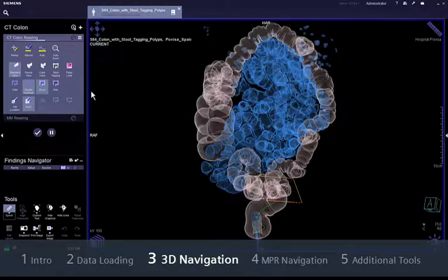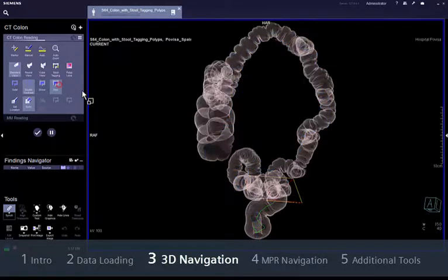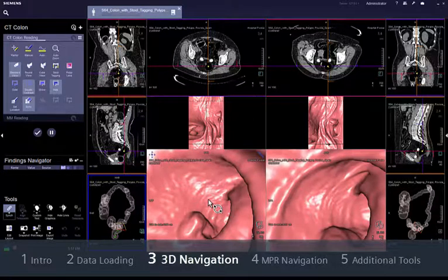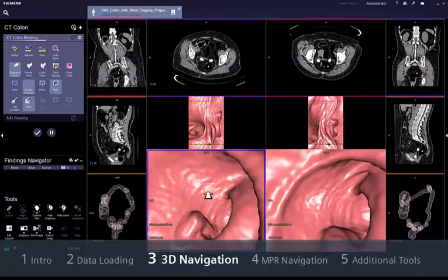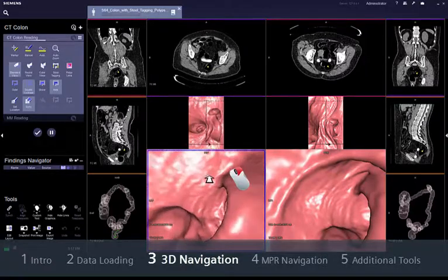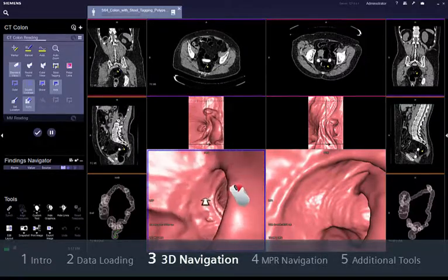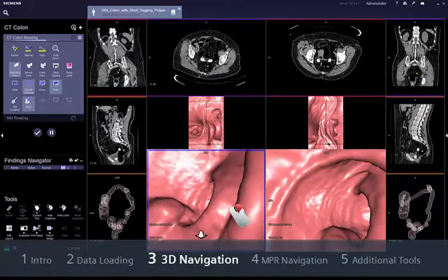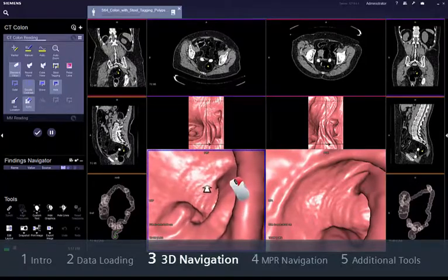Let's start the fly-through in the endoluminal segment of the supine data set. The virtual endoscope is automatically positioned in the rectum and ready to start navigation. Just hold the right mouse button and drag it forwards or backwards in the centre of the segment to control the direction and speed of navigation.